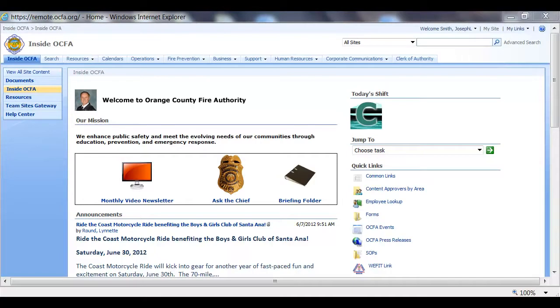In this database, we'll be tracking all of our equipment, and that includes things like ZOL monitors, AEDs, ZOL batteries, ZOL charging units, impact suction units. We'll also be tracking all of the equipment in our battalion loaner caches, and we'll also be tracking equipment in the service center, things like our mannequins and nurse educator training equipment.